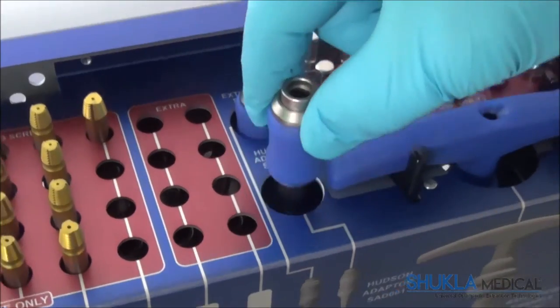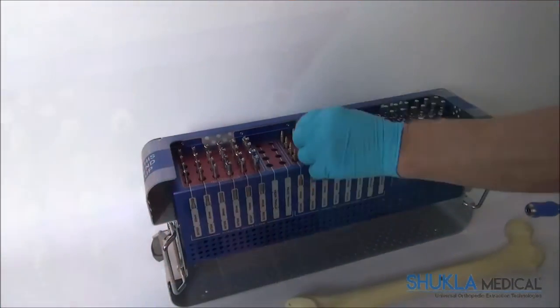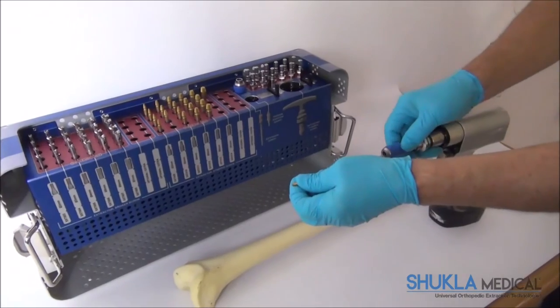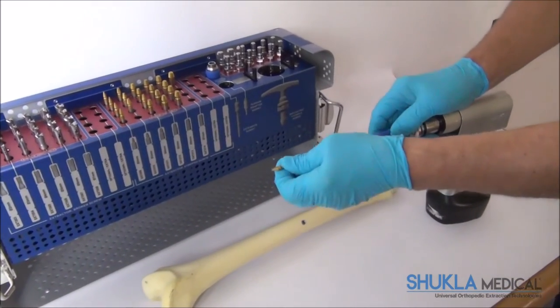Like the broken screw extractors, the stripped screw extractors may be used under power, utilizing the Hudson Extractor Interface, or by hand, utilizing the T-Handle.